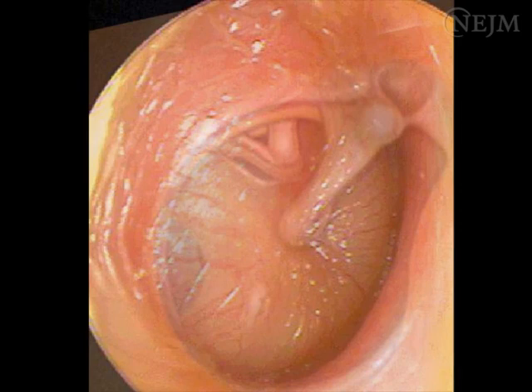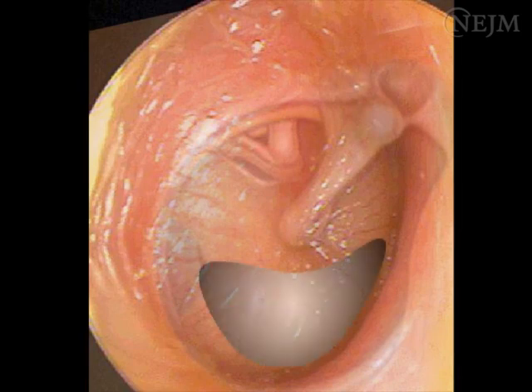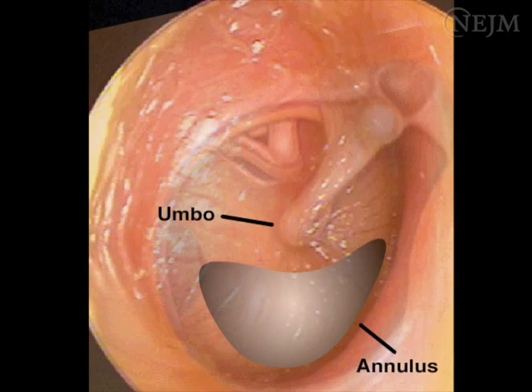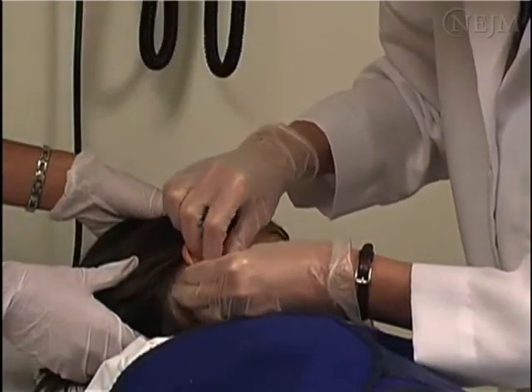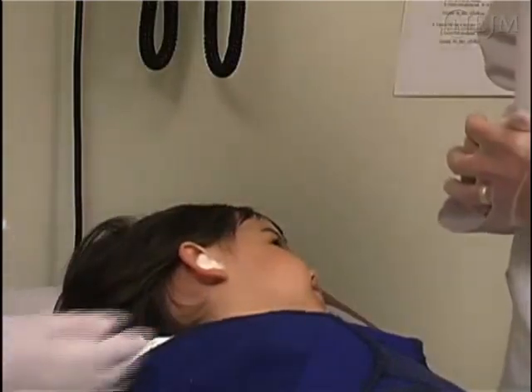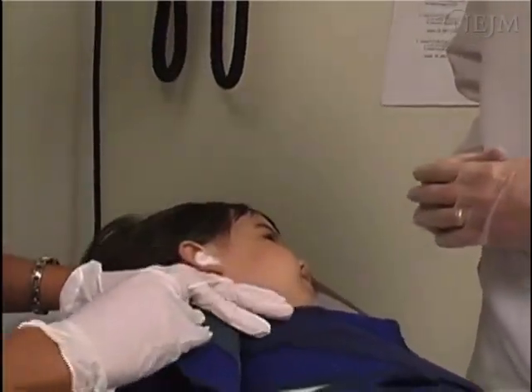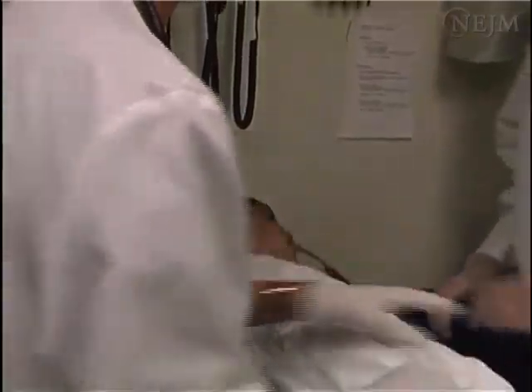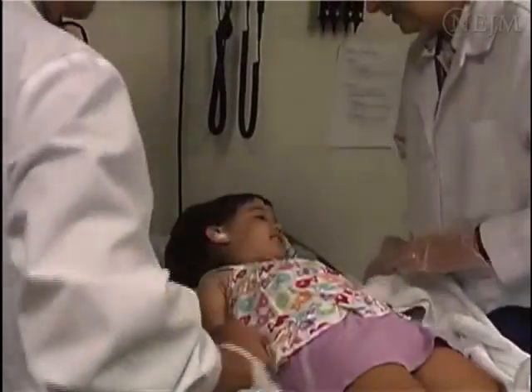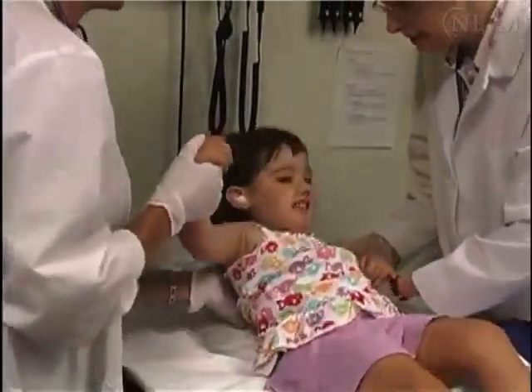Damage to the oval window, ossicles, or facial nerve can be prevented by ensuring that the needle is inserted in the inferior portion of the tympanic membrane. Bleeding can be minimized by avoiding puncturing the tympanic membrane near the umbo or annulus. In case of profuse bleeding from either the external auditory canal or a high-riding jugular bulb, the external auditory canal can be packed with a cotton ball soaked in oxymetazoline. Having the child sit up and having the parent soothe the child to reduce the pressure caused by crying may also help reduce bleeding.